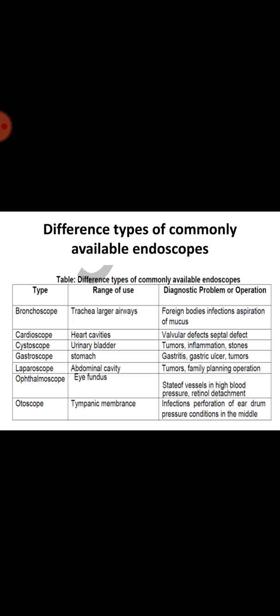To date, more than 5 lakh capsule endoscopy procedures have been carried out and nearly 1,000 articles have been published covering this clinical use. The procedure doesn't require an overnight stay in the hospital and usually only takes around 1 hour to complete. The doctor will provide instructions about the preparation and procedure.